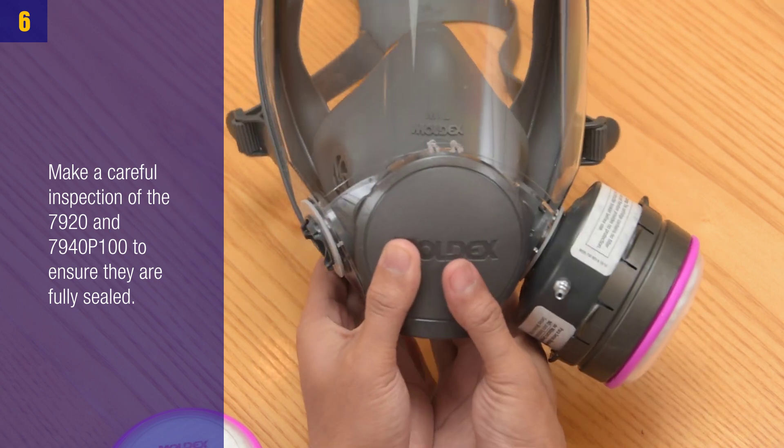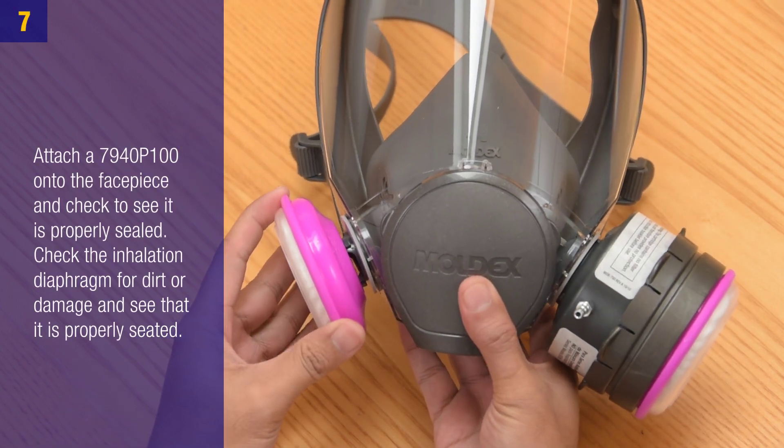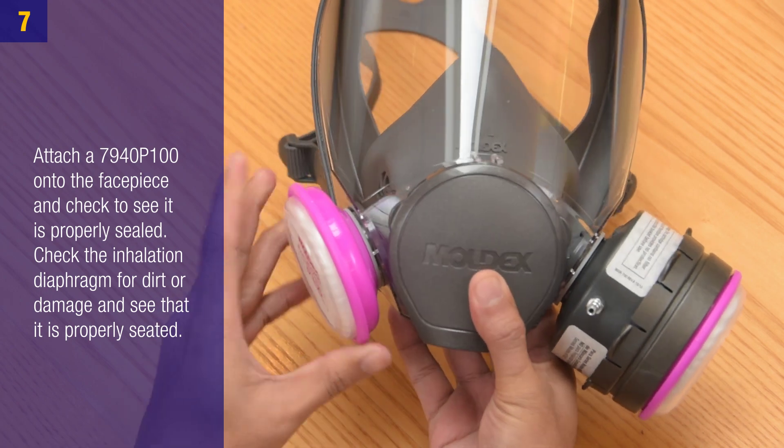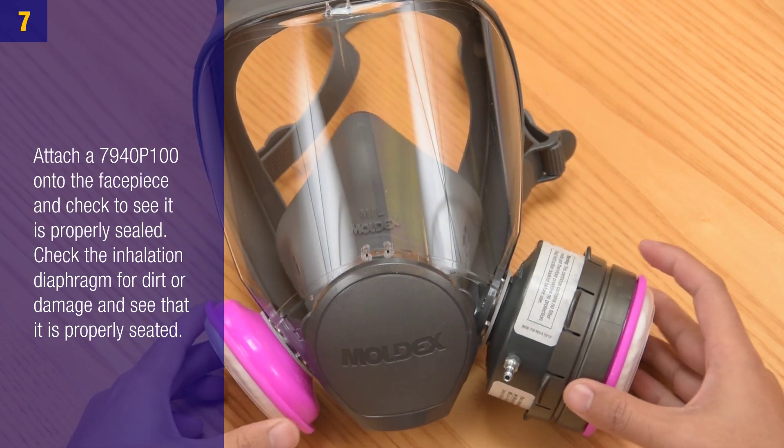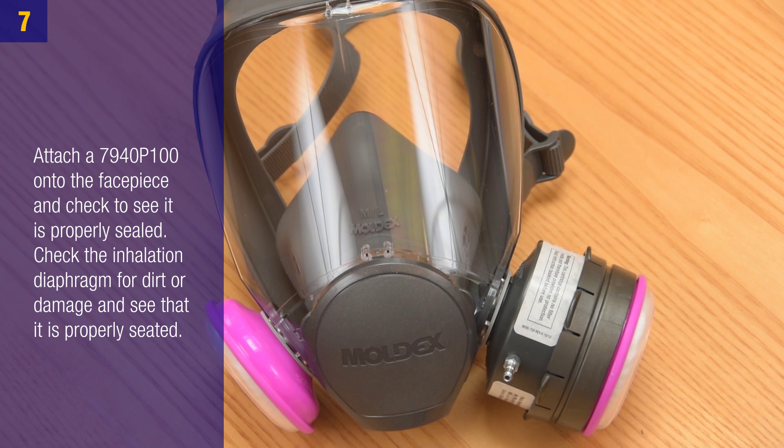Step 6: Make a careful inspection of the 7920 and the 7940 P100 to ensure they are fully sealed. Step 7: Attach the 7940 P100 onto the face piece and check to see if it's properly sealed. Check the inhalation diaphragm for dirt or damage and ensure that it is properly sealed.